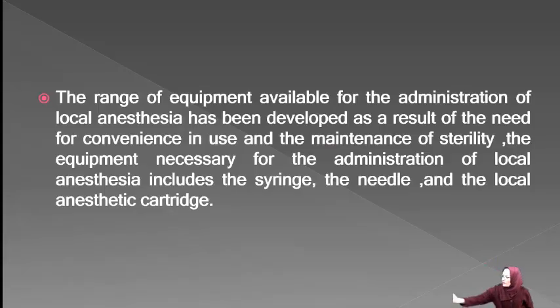Equipment. The range of equipment available for the administration of local anesthesia has been developed as a result of the need for convenience in use and the maintenance of sterility. The equipment necessary for the administration of local anesthesia includes the syringe, the needle, and the local anesthetic cartridge.